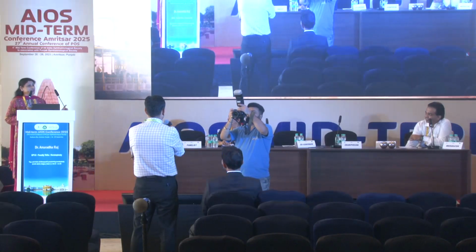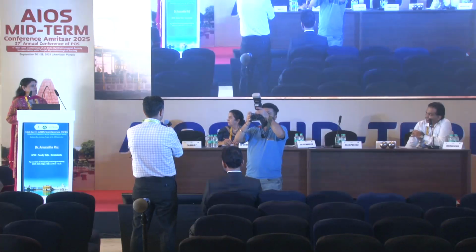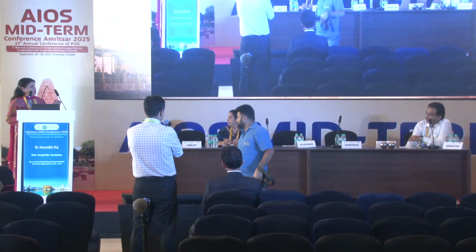In our institute, only a first year anesthesia resident is there. He is coming. I said, do you know for what stage I have hired you? He said, no ma'am, you just tell me. I always tell, when I am just refining, just starting the trephination, maintain the lower arterial pressure. Then they reduce the BP and then I start. Otherwise, I don't start. This is my first instruction to GA people. Because they don't use inhalation. They think this is a small case, so they will not give inhalation anesthetic, for faster recovery. So you should tell them we need deep anesthesia.